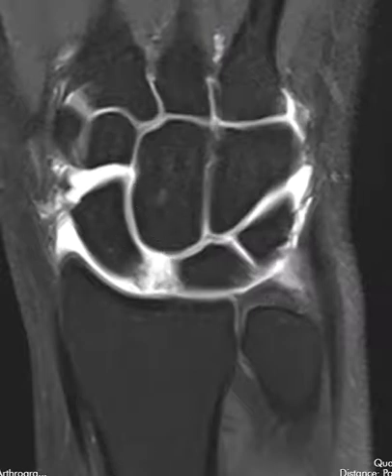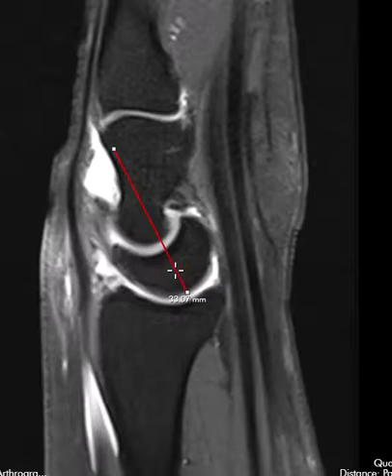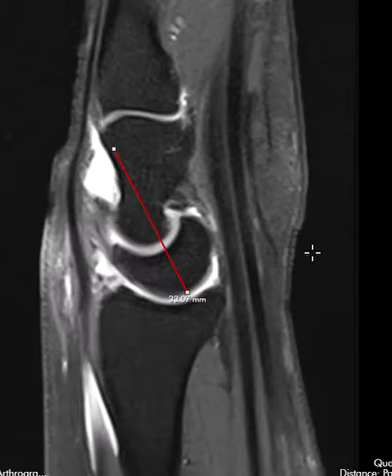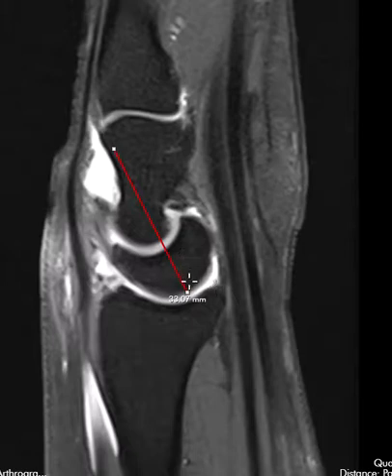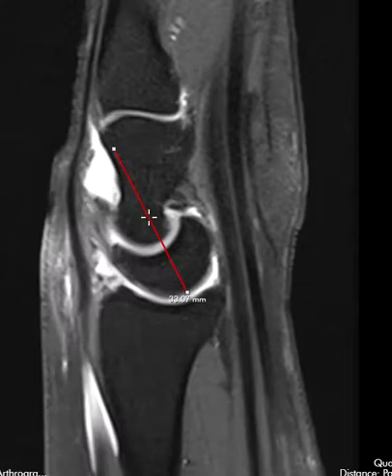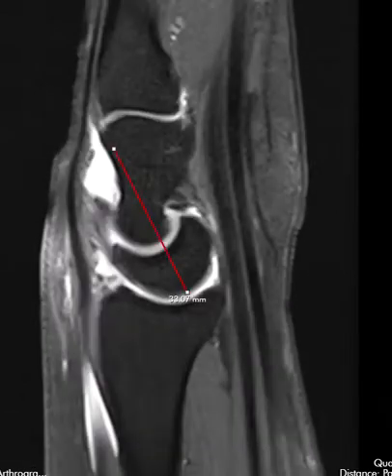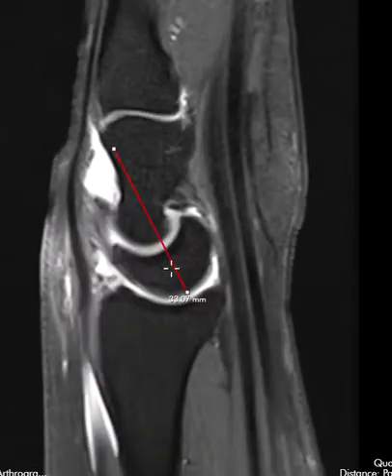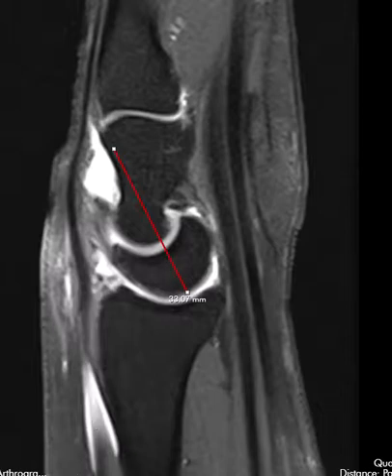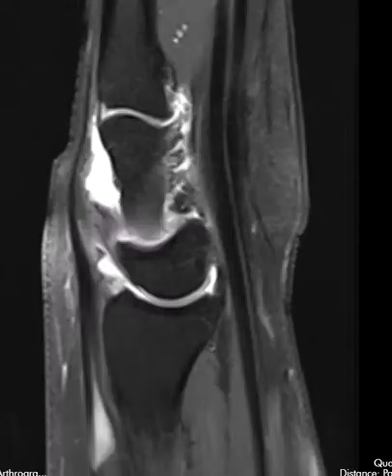Now if we look on a sagittal view, with that ligament injury we can see the lunate bone here is angulated dorsally — this is the dorsal wrist, this is the palmar wrist. The dorsal tilt of the lunate bone will be associated with posterior subluxation of the capitate bone here — it looks like it's pushed back ever so slightly. When it's tilted like this we call it dorsal intercalated segmental instability — DISI.